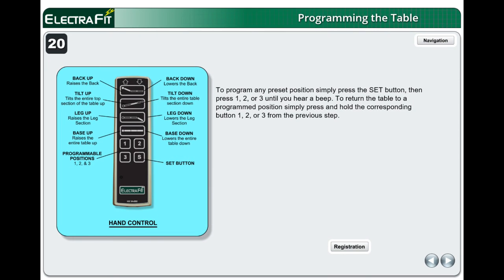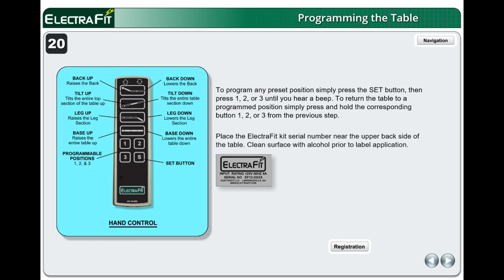To program any preset position, simply press the SET button, then press 1, 2, or 3 until you hear a beep. To return the table to a programmed position, simply press and hold the corresponding button 1, 2, or 3. Place the ElectraFit kit serial number label near the upper back side of the table. Clean the surface with alcohol prior to label application. Congratulations — the table is now complete.